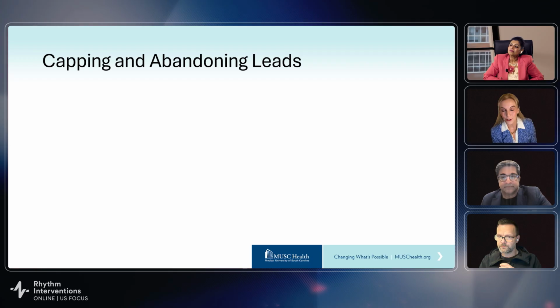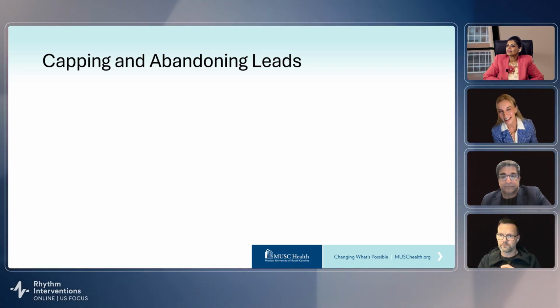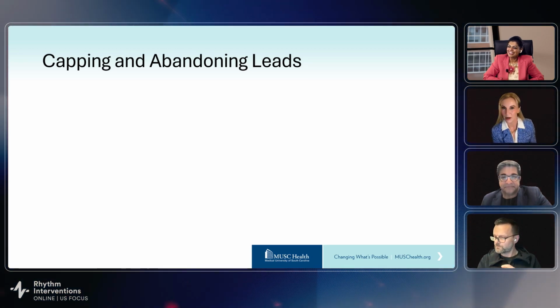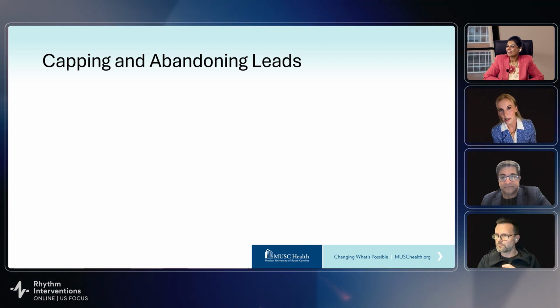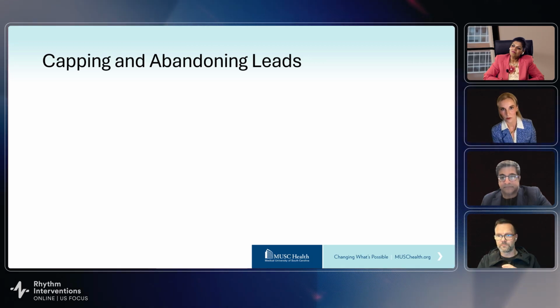And as my surgeons love to say when we're up in the OR doing really old leads, they're always impressed. They always tell their CT surgery residents, a little bit of pressure on the venotomy site, look how well non-heparinized blood clots. Isn't this amazing? They've always reminded me that, especially right at the access site, a little bit of pressure, and then some purse strings and hemostatic sutures will do.